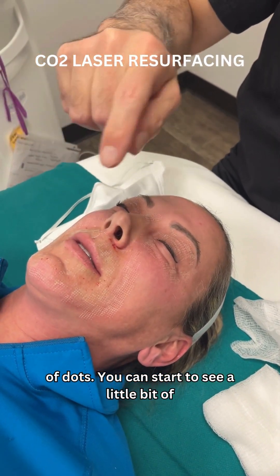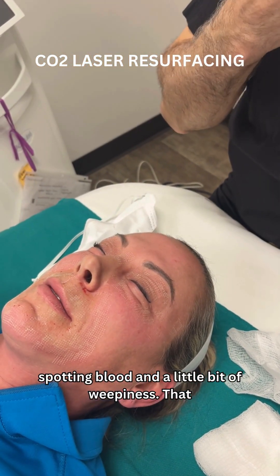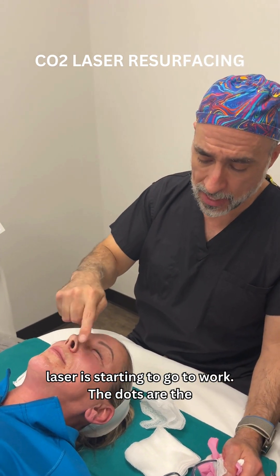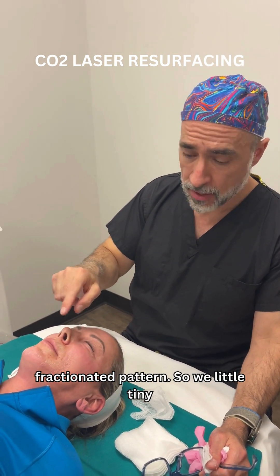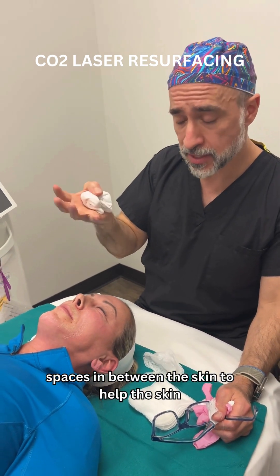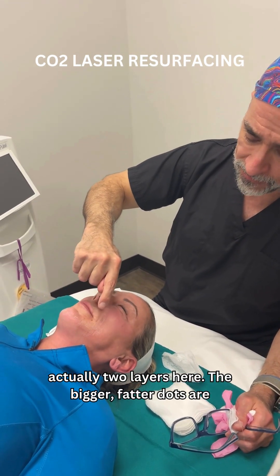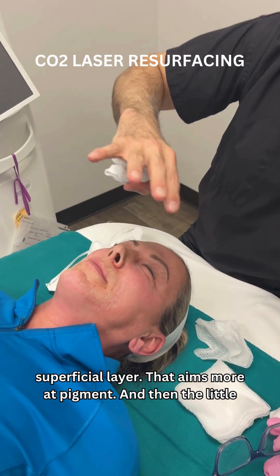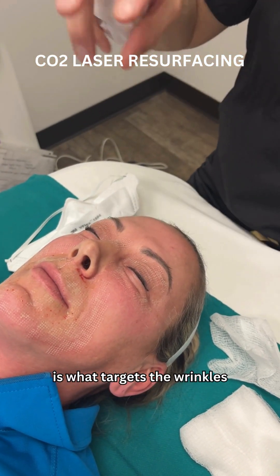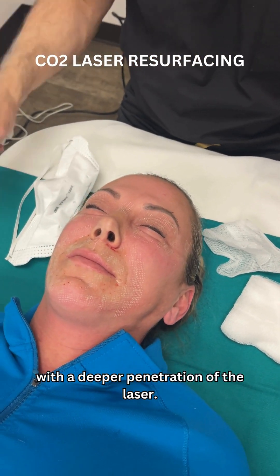So you can see the pattern of dots. You can start to see a little bit of spotting of blood and a little bit of weepiness. That shows that the light controlled burn of the laser is starting to work. The dots are the fractionated pattern — we have little tiny spaces in between the skin that help the skin heal more quickly and allow us to do this awake. There are actually two layers here: the bigger, fatter dots are a superficial layer that targets more pigment, and then the finer dot pattern underneath is what targets the wrinkles with a deeper penetration of the laser.